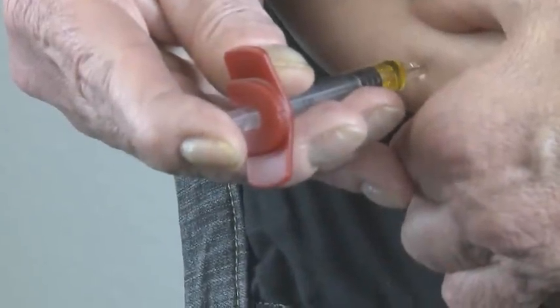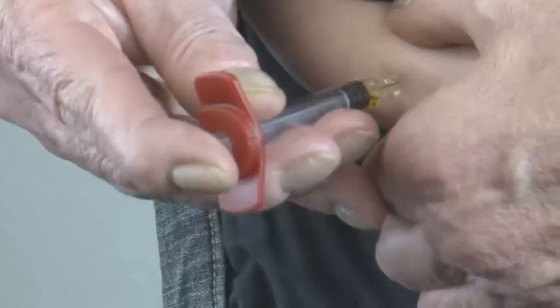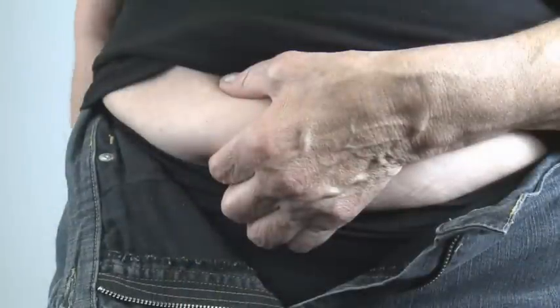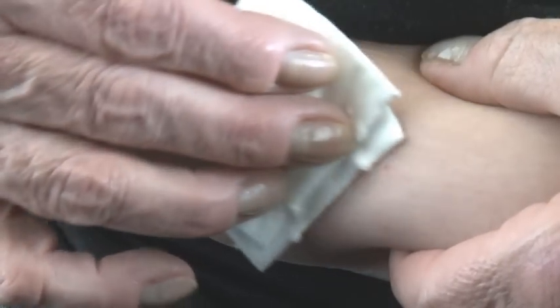Push the plunger slowly to inject the entire contents of the syringe. A small amount of air injected with the drug is completely harmless. Slowly pull the needle straight out and dab the injection site with clean cotton wool or a swab. Do not rub the injection site as this may irritate the skin.